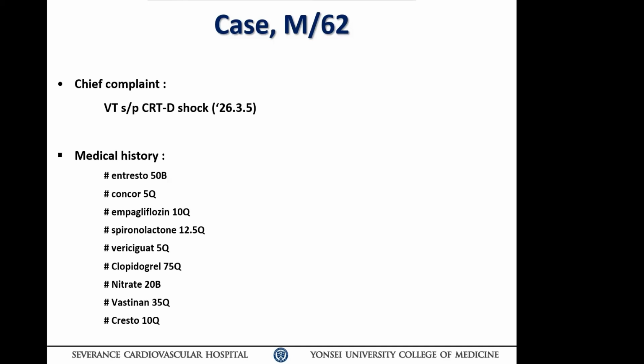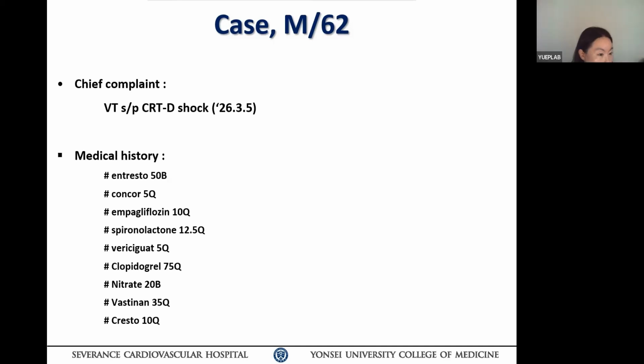So I'm not comfortable because the sinus heart rate is also very fast in this patient. But since the patient has had multiple ICD discharges and some of the VTs were in the VT monitoring zone, if we give more antiarrhythmics, it will again further slow the VT, and the VT will be ongoing. So I think in this scenario, ablation will definitely help, if not reduce mortality, it will certainly reduce ICD discharges, and also take care of the VT, because antiarrhythmics are going to slow down the VT and they will be always in the VT monitoring zone, but patient will be in persistent VT.